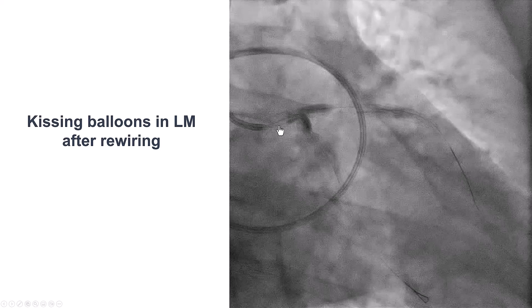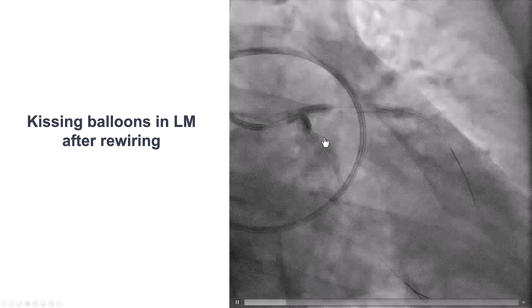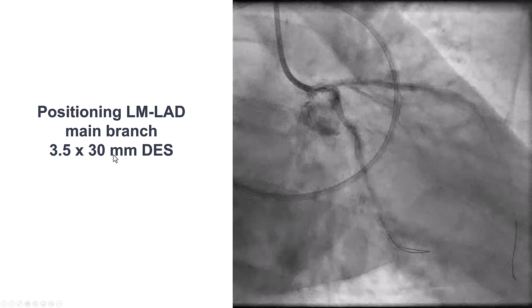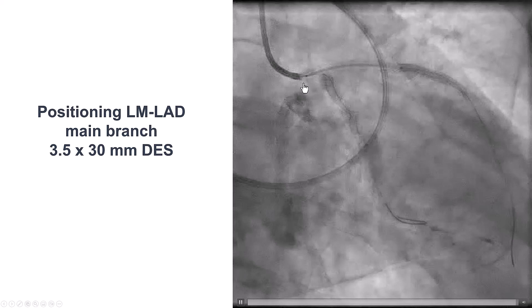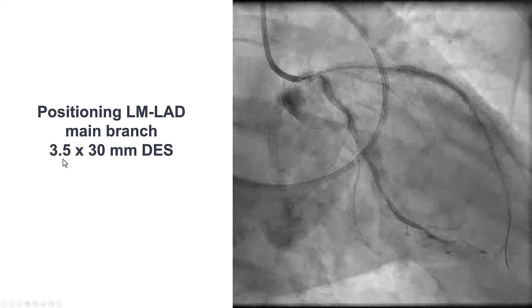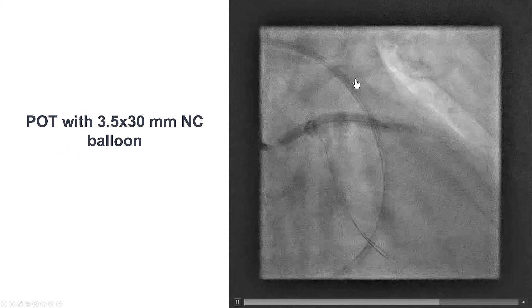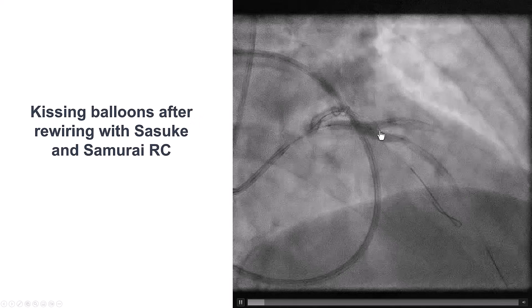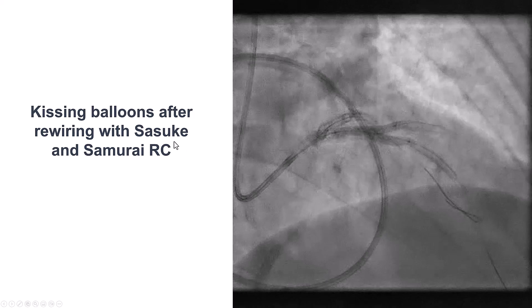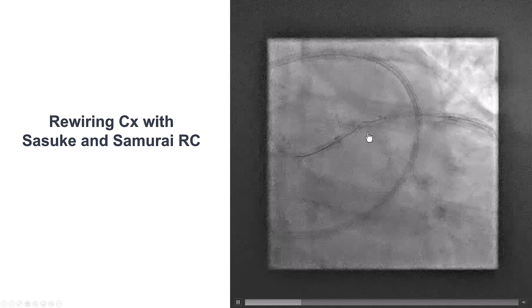The next step is to stent from the left main to the middle LAD, then rewire both branches and do the final kissing balloon inflations. This is a 3.5 by 30 mm drug-eluting stent. When we have a big size mismatch, the left main should be much larger than either the LAD or the circumflex, so having a stent that can go to large diameter is very important. We know that the 3.5 Zion stent can go all the way to 5.75. This was deployed, we did the proximal optimization, then we rewired the diagonal and did the kissing balloon inflation. Rewiring was challenging so we used a dual lumen microcatheter, and then we did the same thing into the circumflex.